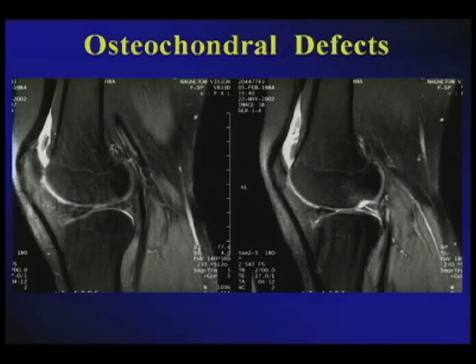This osteochondral defect now, for confirmation, might necessitate, because of its intraarticular nature, an MRI. Here in the fluid-sensitive T2 sequence with fat saturation, around the fundus of the suprapatellar recess, you'll see this osteochondral defect, but it's actually the loose body of the osteochondral defect.